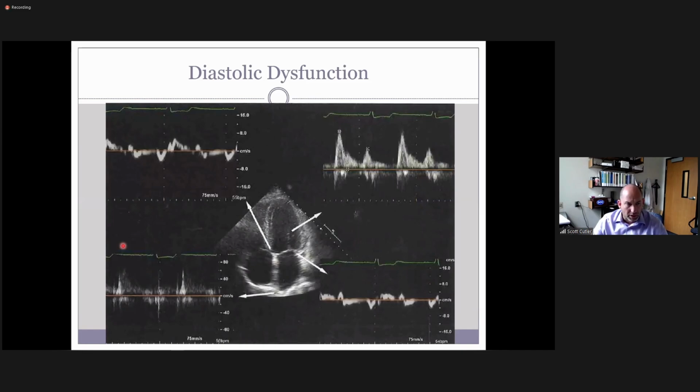And again, just showing diastolic dysfunction overall. This is not non-compaction. This is just general diastolic function. Those are just the waveforms that you take to obtain that. Those are really crappy pulmonary veins. Sorry, that's a poor example of pulmonary veins.